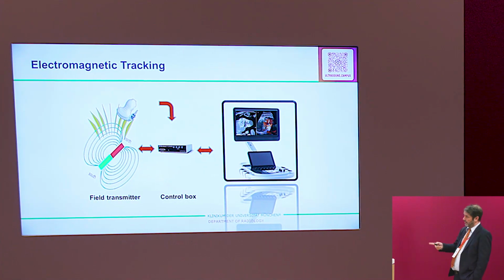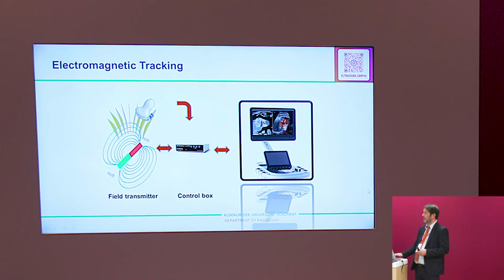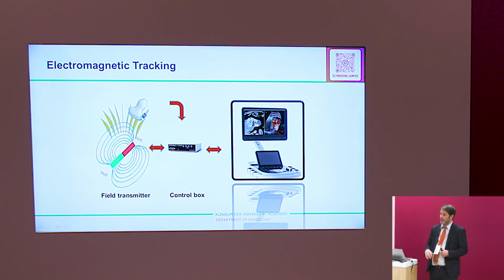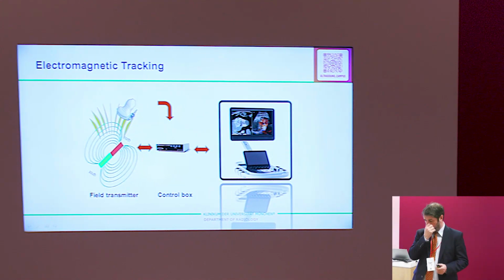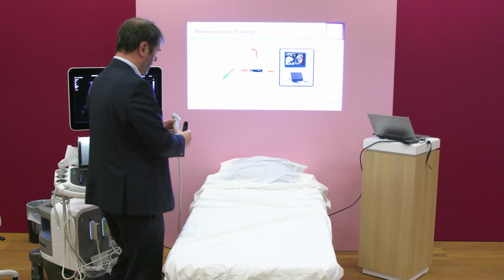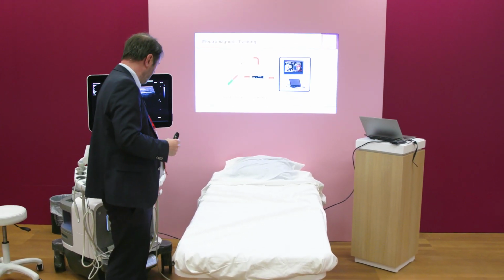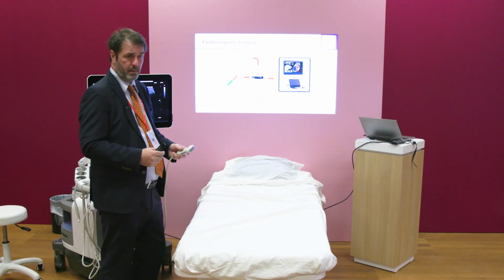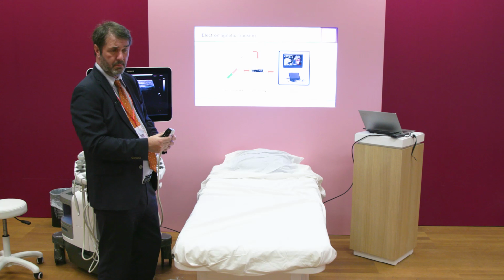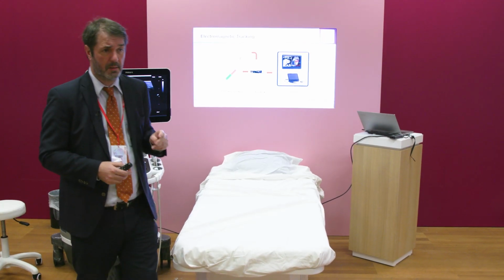So you see our magnetic field generator, then you see a sensor which is connected to the probe there. The new generation of probes, for example this probe here, has a sensor already included. The older generation of probes, like this, has an external bracket where the sensor is connected. But of course, a sensor is needed.